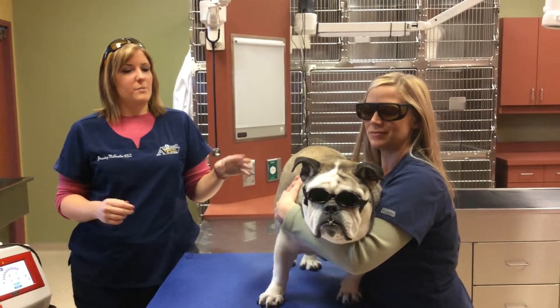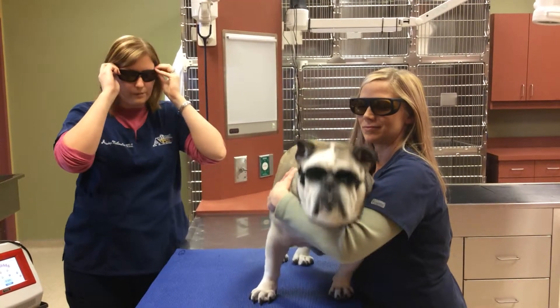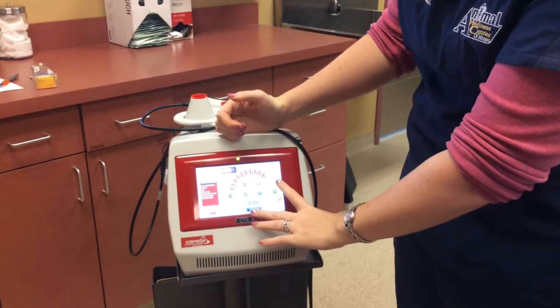To start, we want to make sure that everybody has their goggles on to help protect from the laser. And we're going to search her in our computer, pull her up, and we're going to treat for arthritis.